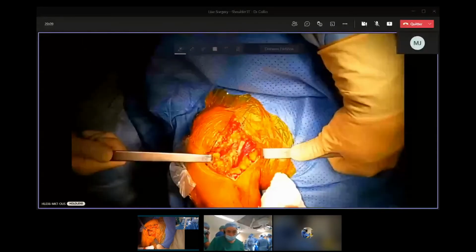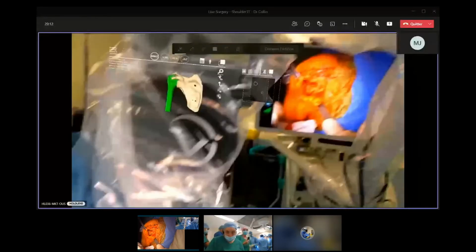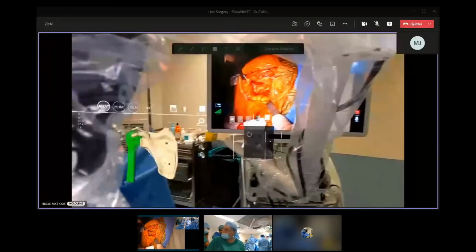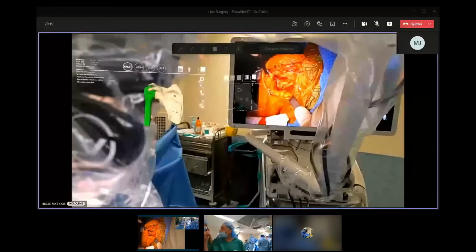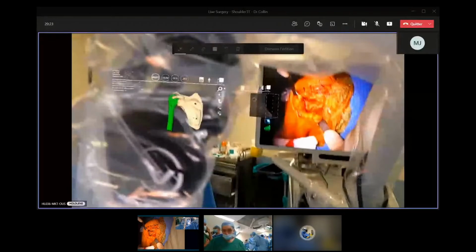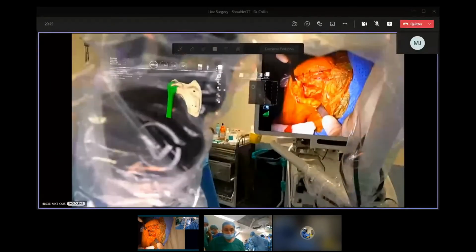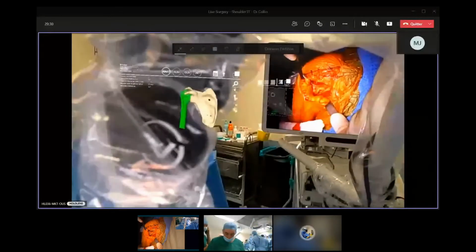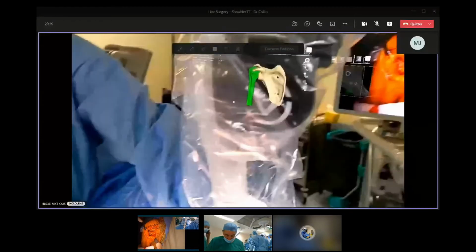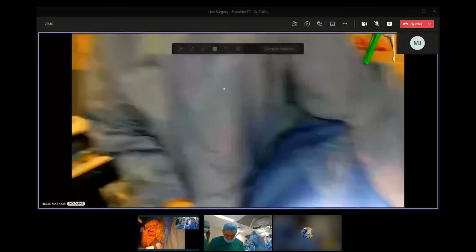So we are going to go. I think it's better, in fact, because we wanted to make for you a perfect live surgery. We thought that it would be better to have this camera. So we are going now to go 100% on the HoloLens. The only thing is I just need to modify a bit the position of the HoloLens on my head. If not, I need to operate with the head like this. So just a couple of seconds, I'm going to do it. Okay?